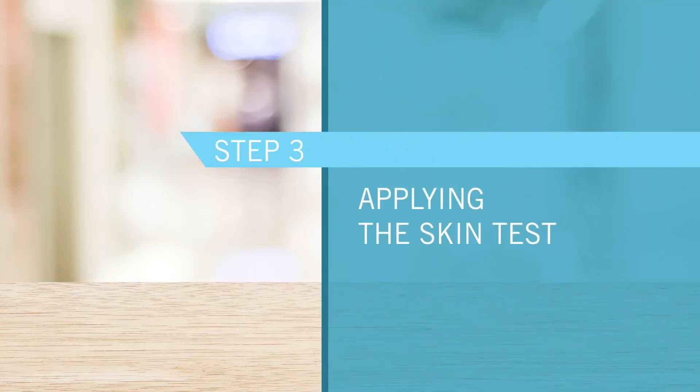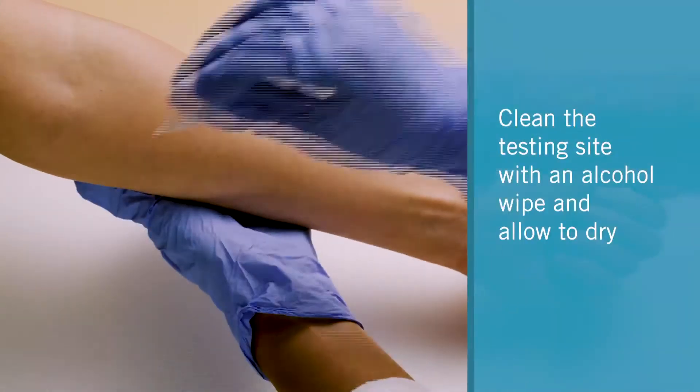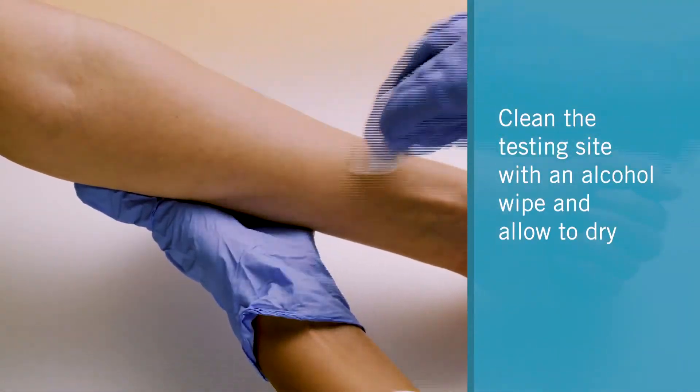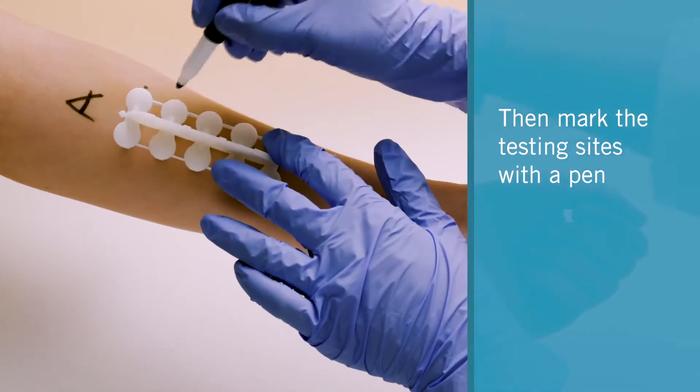Step 3: Applying the Skin Test. Clean the testing site with an alcohol wipe and allow to dry. Then mark the testing sites with a pen.